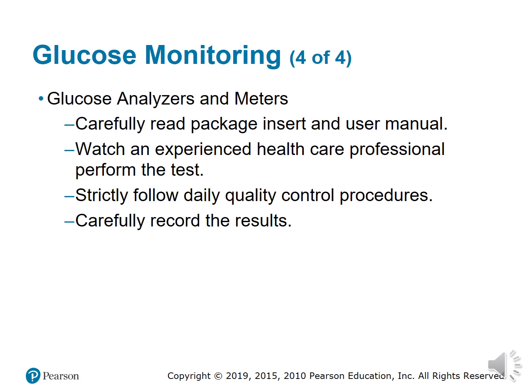So we have to know how to use each different type of POCT instrumentation, especially if it's a skin puncture, to see which drop we need in order to get an accurate reading. So make sure you carefully read the package insert and user manual for each new POCT testing monitor.